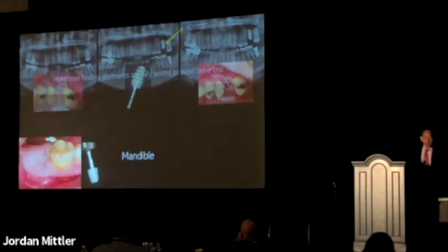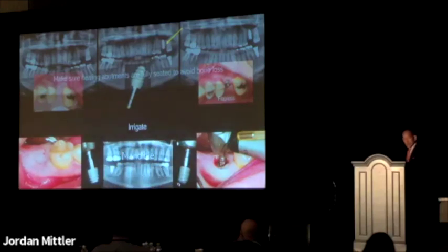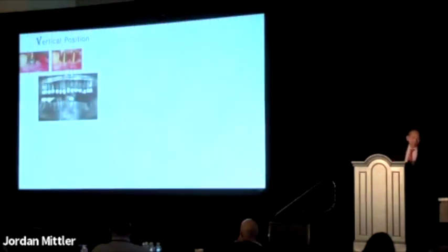Now in the mandible, I do the same thing. Make a little nick in the gum. I push the tissue out of the way. And one of the differences on the mandible, you can often have saliva. When you do flapless surgery in the mandible and you stick that implant in and you hit the tissue first, and there's a bunch of bacteria there, now you're driving that implant and all that bacteria to that rough surface inside the implant. So you can wet the implant, and you can see it's flooded with water, so that the first thing that the implant touches is not bacteria.